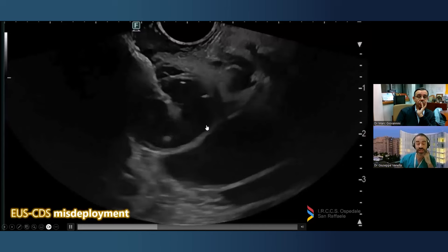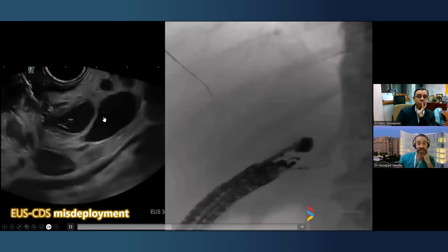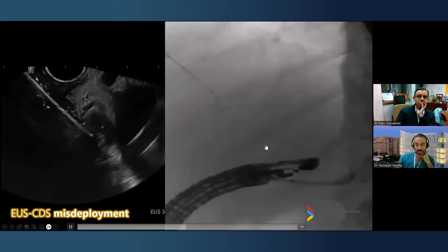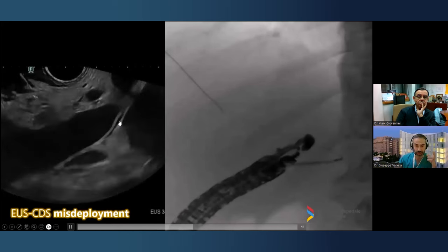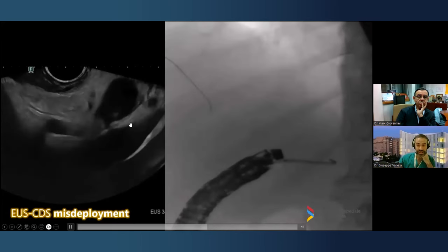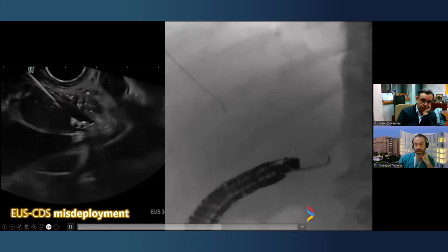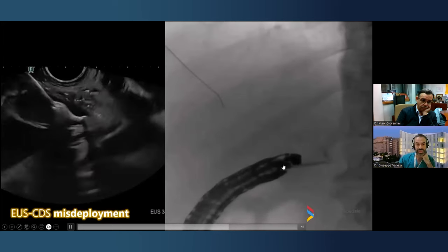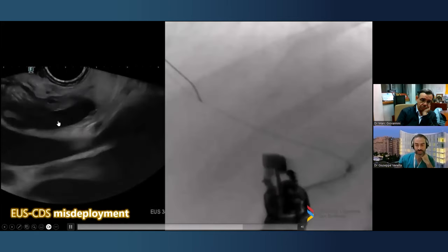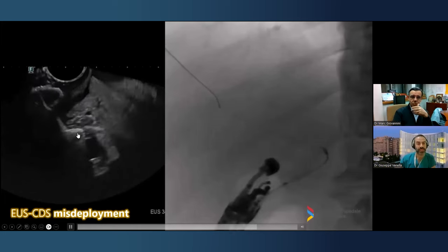So I advanced a guide wire. In this case, I recaptured the stent, I retracted the catheter, and I tried to go for a novel release. And as you can see here, not a very nice position, not towards the lumen. So I had to make some movement of the scope to gain a good direction towards the lumen. And then I was able to advance the catheter a bit and to go for the release of the distal flange of the stent with some pushing to let it open inside the bile duct, and then again retraction and opening of the proximal flange, and now this is completely released.